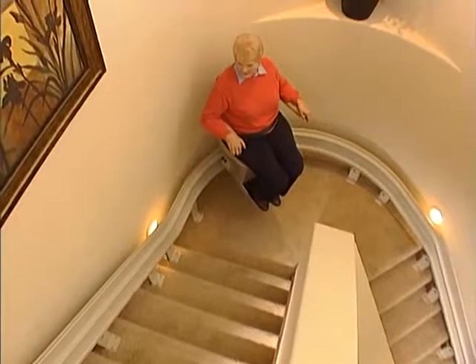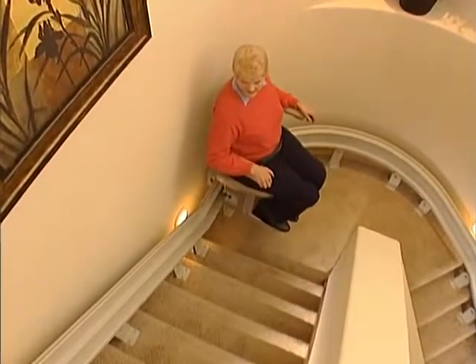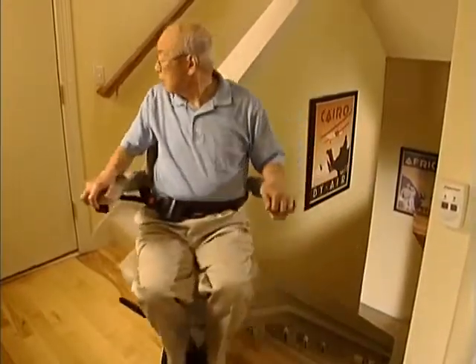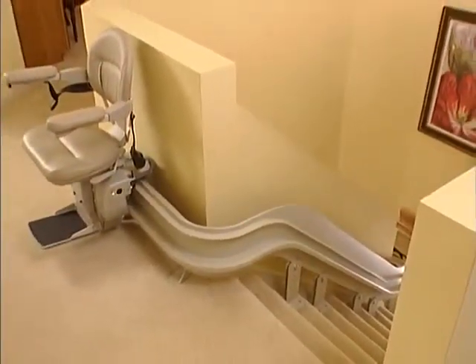Your lovely home has an impressive curved staircase, but now it has become a barrier to independence for at least one member of your family. The Bruno Elite Custom Curved Rail Stair Lift is the solution — not just functionally, but aesthetically. Let Bruno make your house a home again.